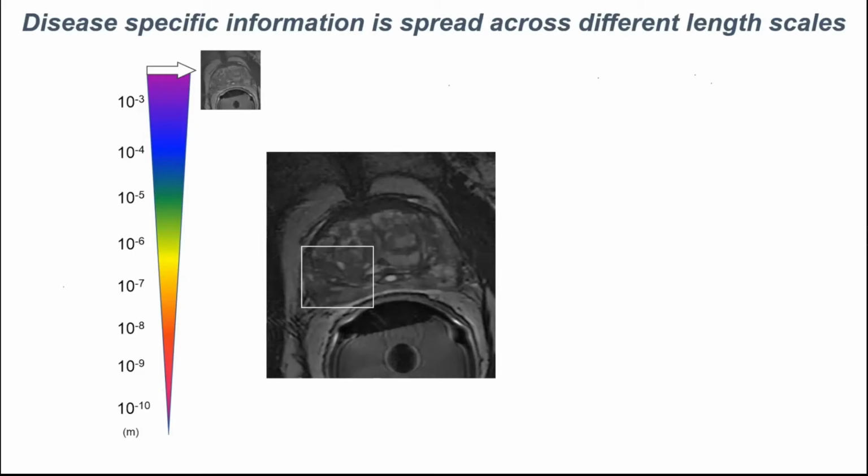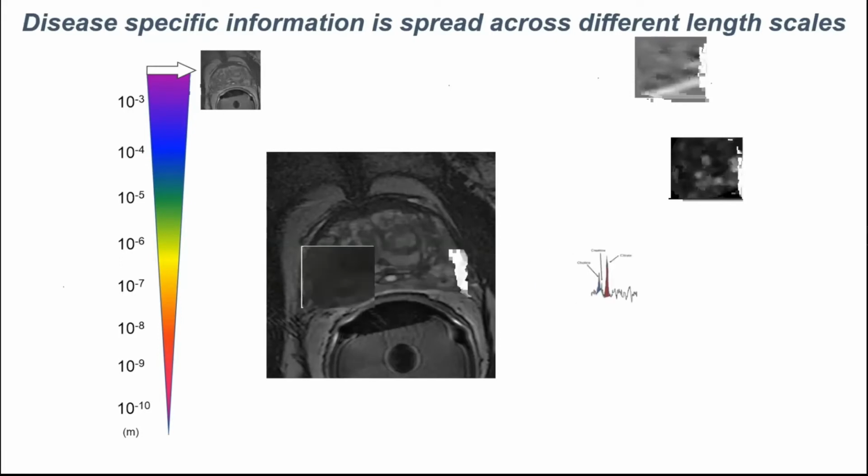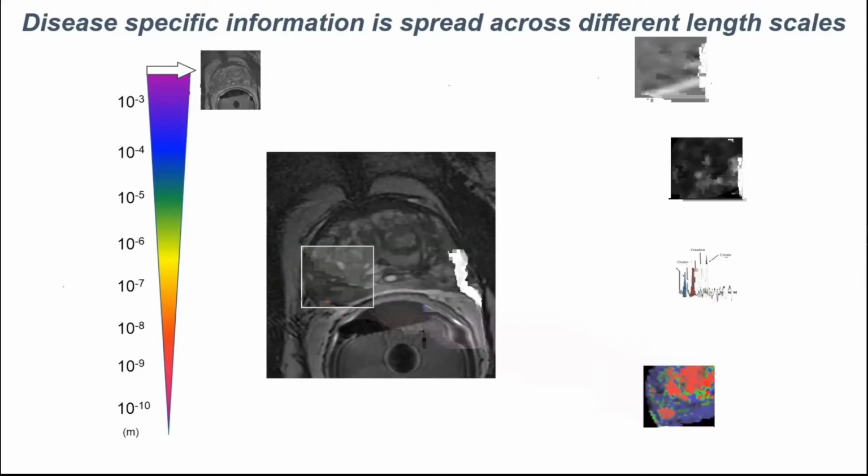As an example, let's look at prostate cancer, where in the context of an individual who has adenocarcinoma, chances are pretty high now that they will get a multiparametric MRI exam. What you're seeing here is an area of adenocarcinoma on an endorectal T2 weighted MRI scan. But with a multiparametric sequence, you can also start to look at other parameters. You can look at diffusion weighted imaging, where you look at water mobility in the tumor. You can look at choline, creatine, citrate, and metabolic concentrations. You can look at the vascular attributes of the tumor through dynamic contrast enhanced perfusion imaging.